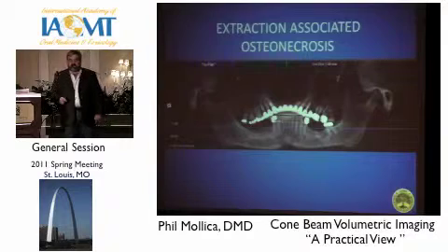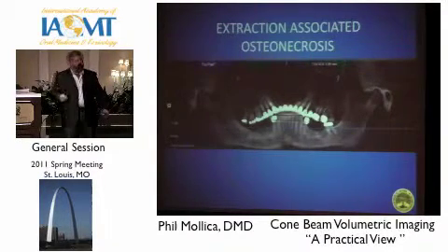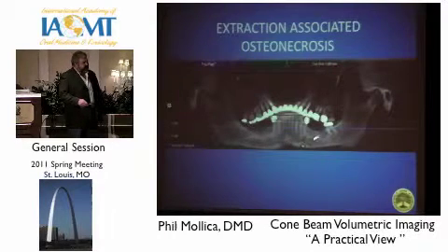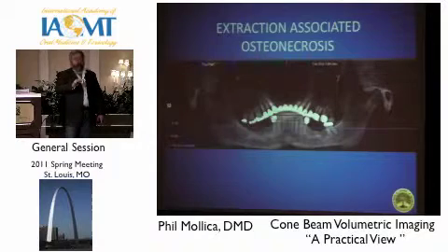When did you have that tooth extracted? Oh, I can't remember. It has to be at least 10 years ago. Okay, all right. We still have this low density area here. Well, why don't we go in, let's travel in.